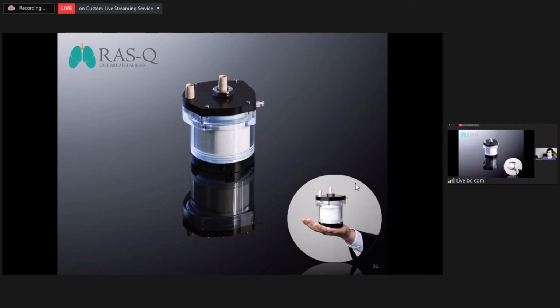The other thing is, if you want to increase the surface area of the oxygenator, which would lead to lesser pressure drop, you would mimic the normal lung's vascular resistance. I think we have been stuck with the same shape of oxygenator for the last 3 decades. Since you're looking at a wearable oxygenator, have you considered other shapes like a wearable belt or wearable jacket, so you can have a very large surface area of the oxygenator so that the pressure drop is very little?